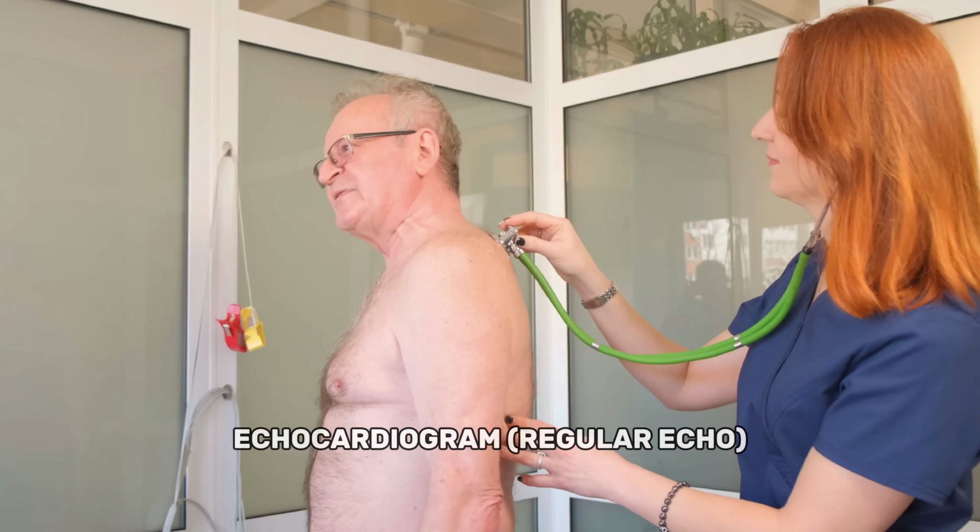Okay. So that is the Holter monitor. It's basically an ECG over a long period of time, like the first test we talked about, but over a long period of time. Okay. And any other test you want to mention? Maybe just probably the echo.